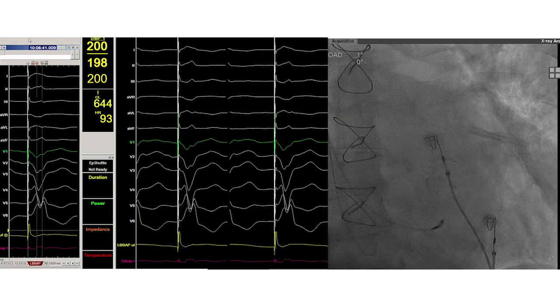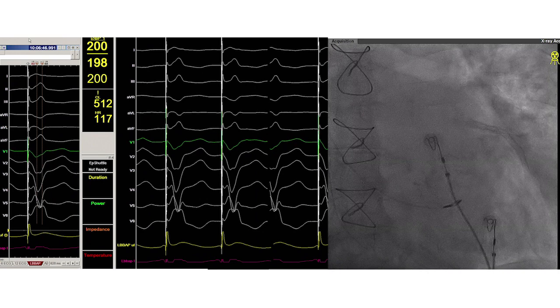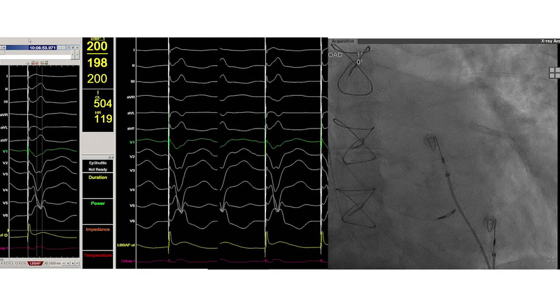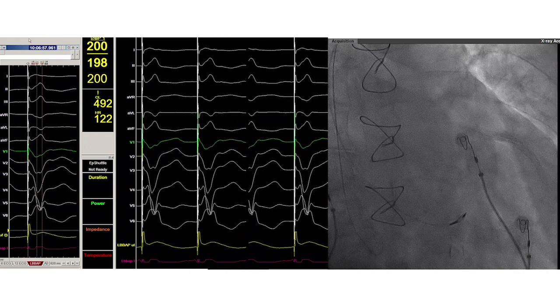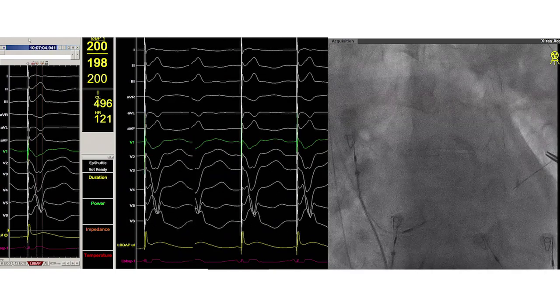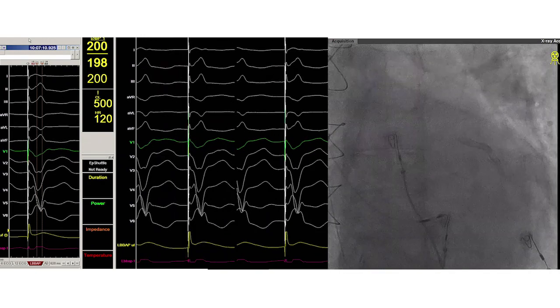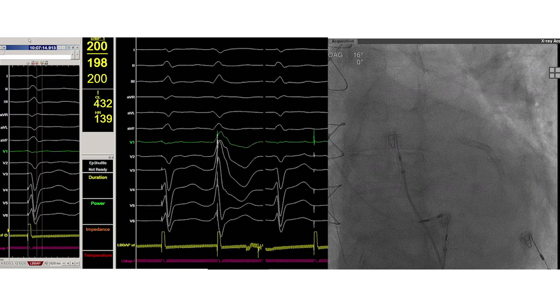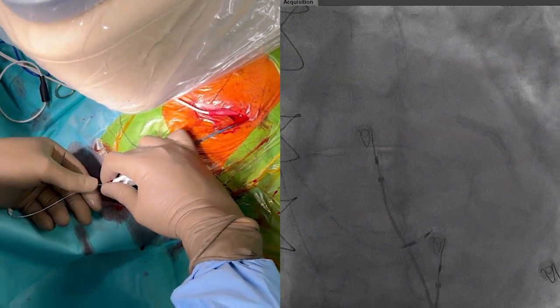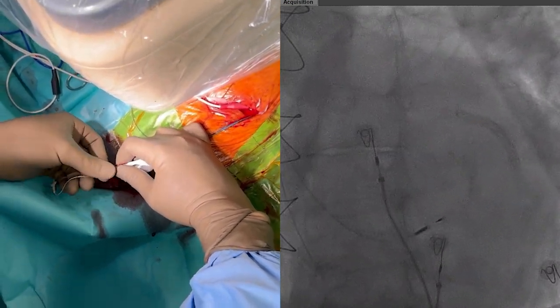Unipolar pacing helps in finding the area of interest, showing a W pattern in lead V1. On the fluoroscopy we can see that the lead tip is against the high basal septum. Turning to RAO view reveals that the lead tip is pointing towards 2 o'clock. In LAO view we confirm that the guiding catheter is placed perpendicular on the septum, and under slight LAO view the lead is advanced into the septum using a few quick turns. Note how on fluoroscopy the lead moves through the interventricular septum towards the LV endocardium.